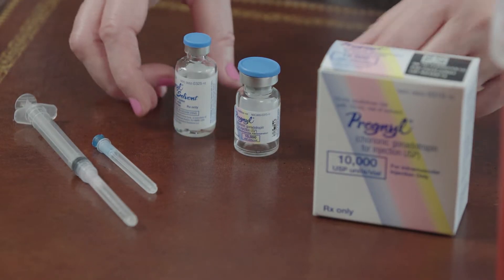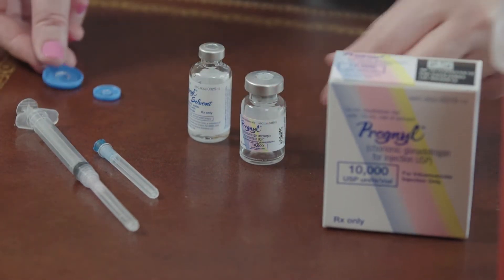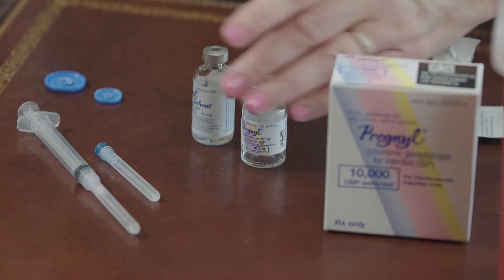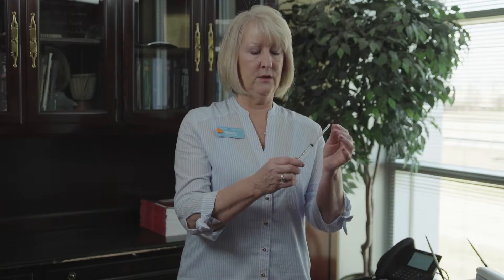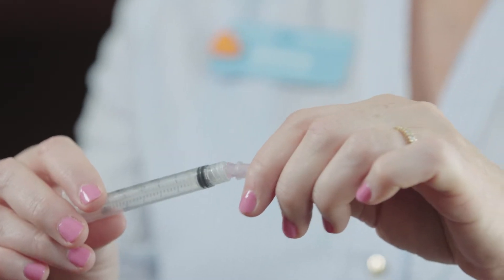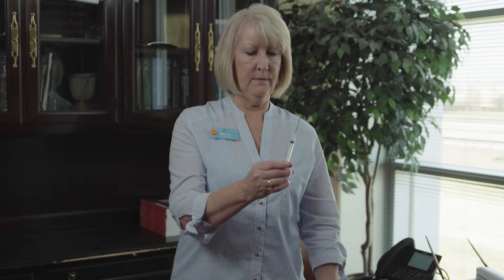You will take your vial of liquid, pop the blue cap off, and your vial of powder. You'll want to swab the rubber stoppers with an alcohol swab. You will take your syringe with the mixing needle — if the mixing needle is not on the syringe you can screw it on easily. Pull the cap off the needle and pull one and one half mils of air into your syringe to add to the liquid.